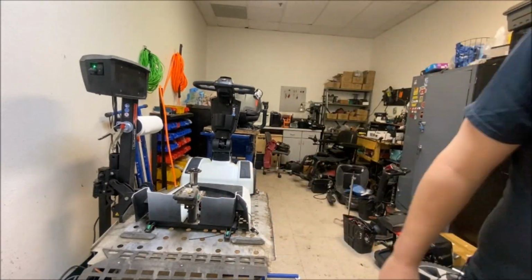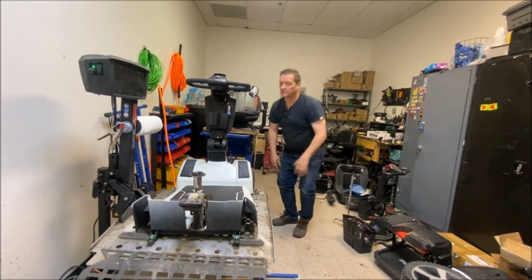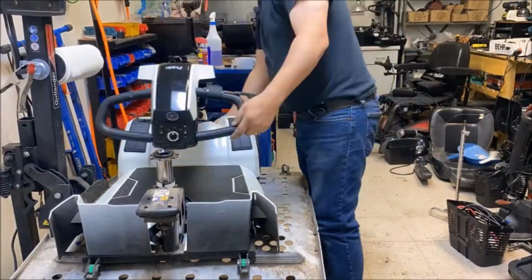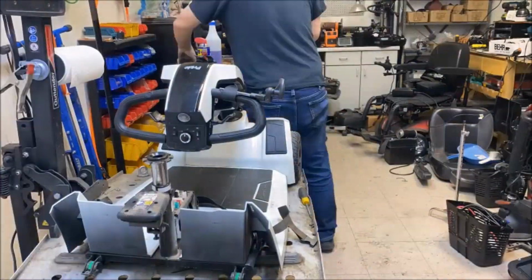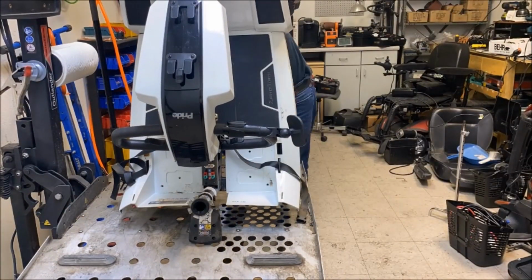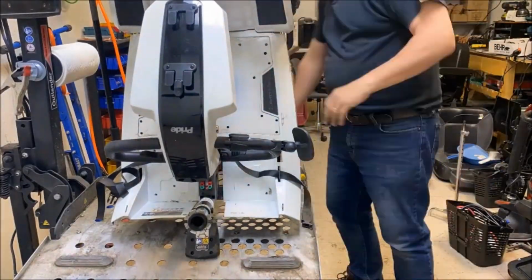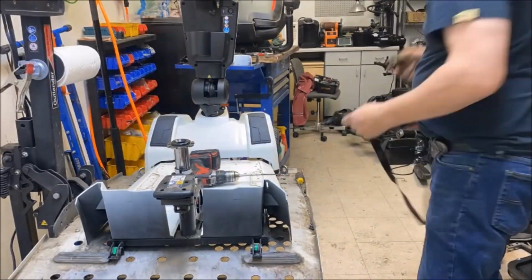Drive the scooter before you take it into your workshop to service, so you can get a good idea if you can hear anything rubbing, anything catching, anything knocking, or things like that. You can maybe identify and address as you're going through the service. I tend to do a methodical front-end service first because it's the hardest. Strip off as much as I can shroud-wise so I can get to see the controllers, see if there's any wire damage.